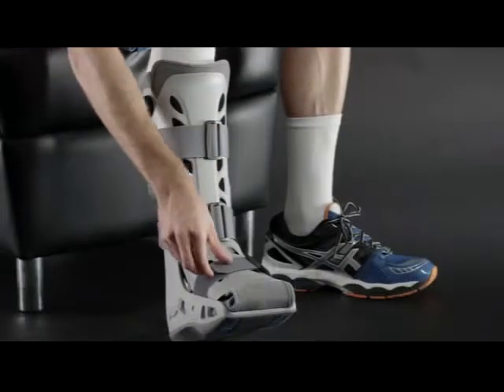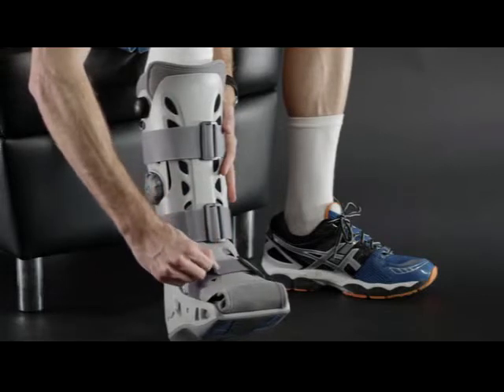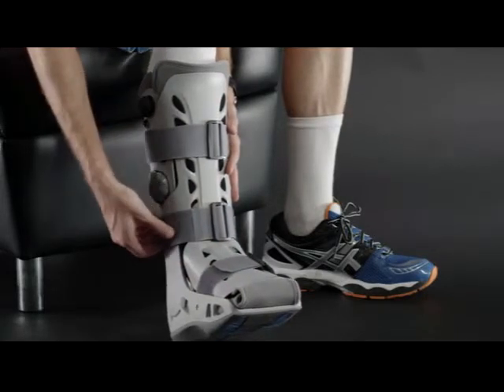At high altitude, the AirCells will expand beyond their optimal level. In this case, you can adjust the pressure by tightening or loosening the straps.